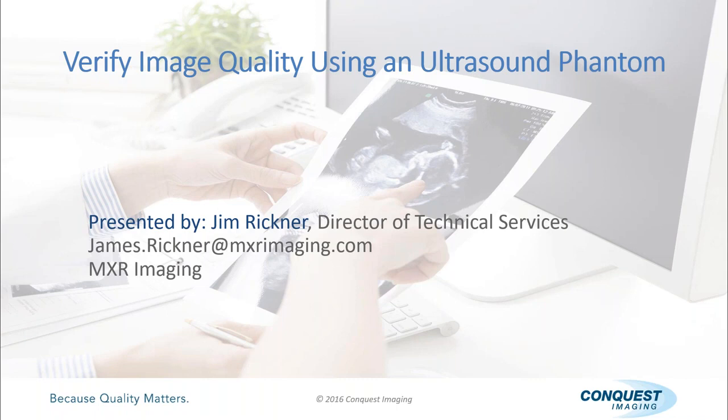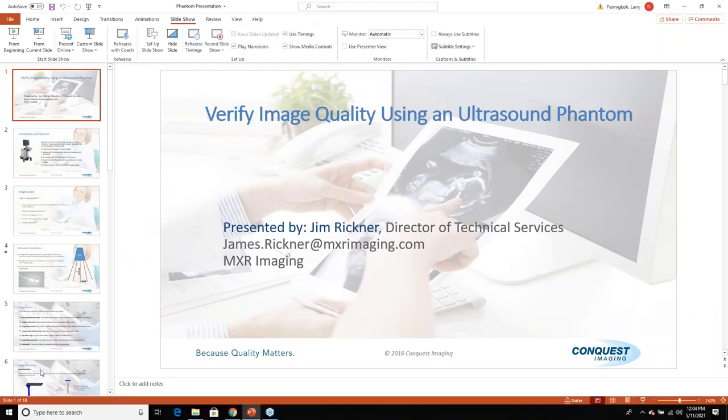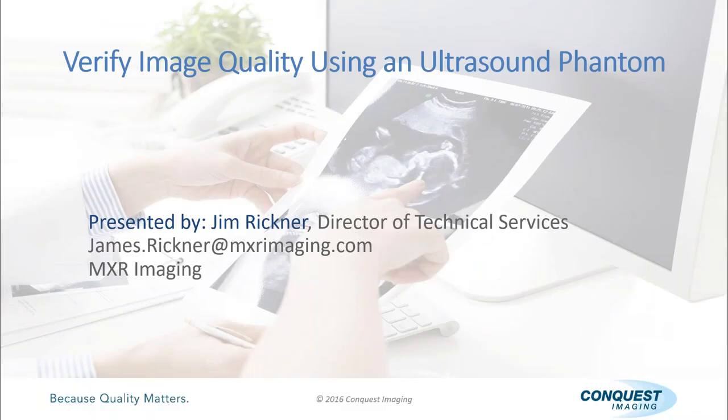I don't know why it would go to sleep, but that's what it's doing. There we go. And now I can't even see the mouse. There we go. Try it again. I wonder if the battery's dead. I don't know. It might be the battery because I'm not getting the laser pointer either, which I don't care about. I'll do it manually in the meantime.